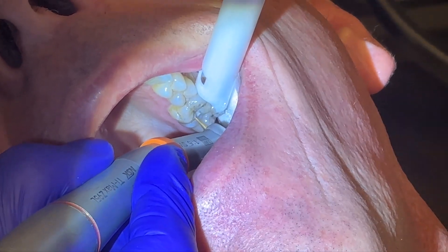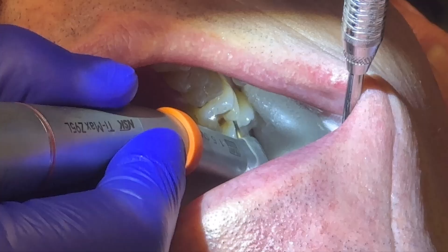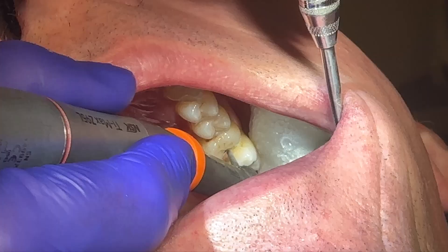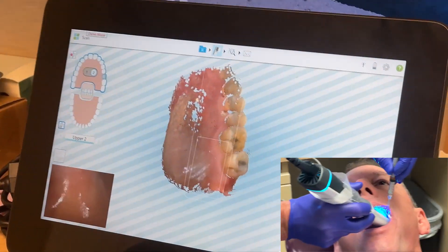Now a little bit of the prep — continuing to contour everything nicely, and then with some finishing touches. After that, we're going to take a post-prep scan using the Itero Lumina as well, of course.